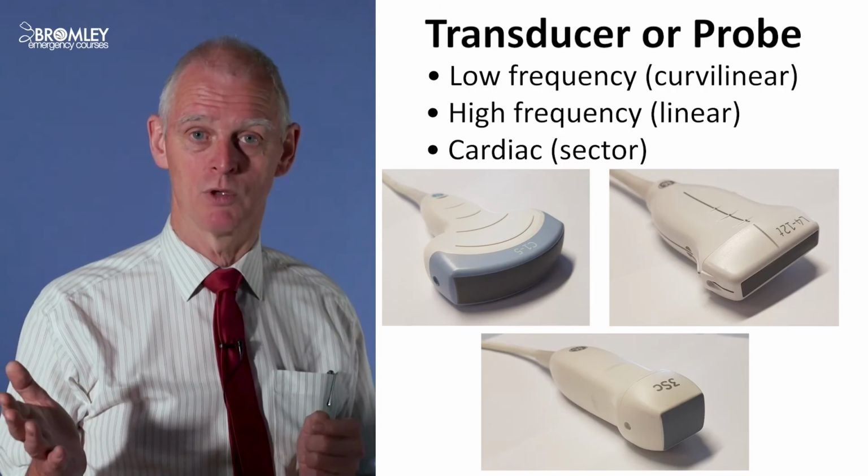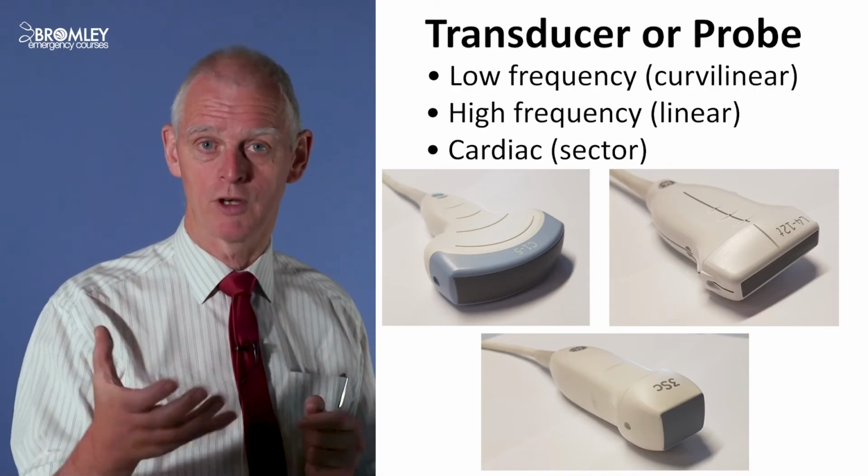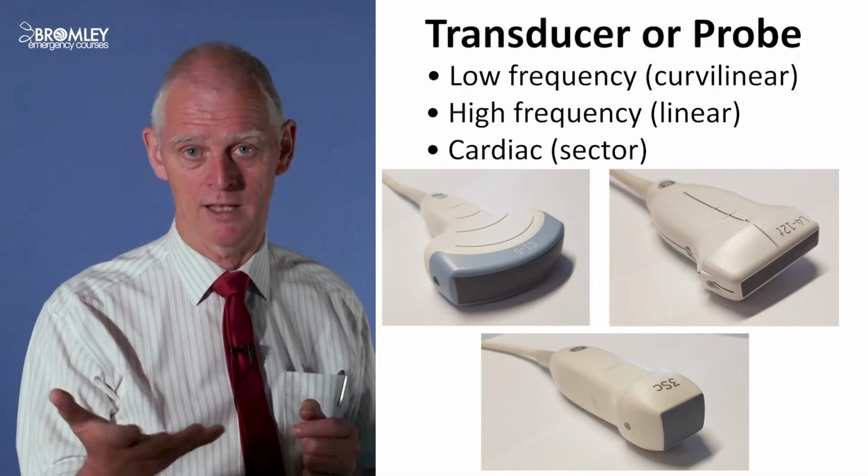And when you choose whichever of those options, the computer will load some additional software designed to clean up the image, to give you the best quality image you can in that application. This is really important, particularly, for example, in echo probes. The heart creates a lot of reverberation and a lot of artifactual stuff. And a lot of work has gone into these presets designed to clean up the image and give you as sharp and clear an image of the heart as possible. So for any application with ultrasound, you make use of the presets, and that will give you the best possible functionality, the best possible images in that situation.